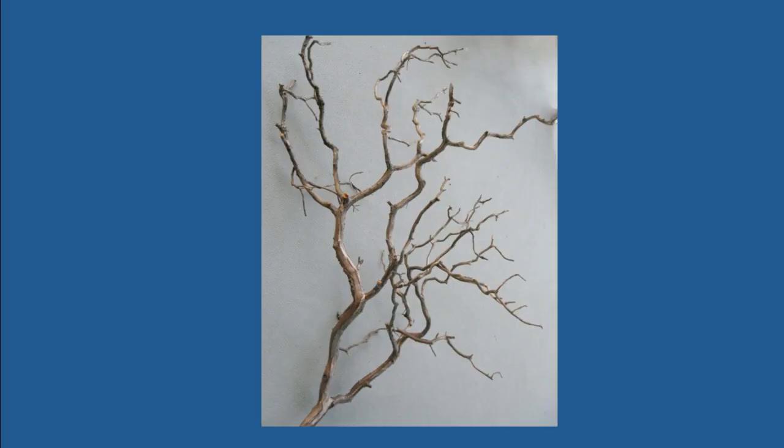Now, continuing on with the portal tracts, one must always keep in mind when looking at a liver biopsy that the portal system is like a branching tree. And although we expect to see perfect cross sections of the portal tracts in our biopsy material, it is entirely possible that the biopsy needle has gone this way or that way, cutting a portal tract either at its branching point or in a longitudinal fashion.